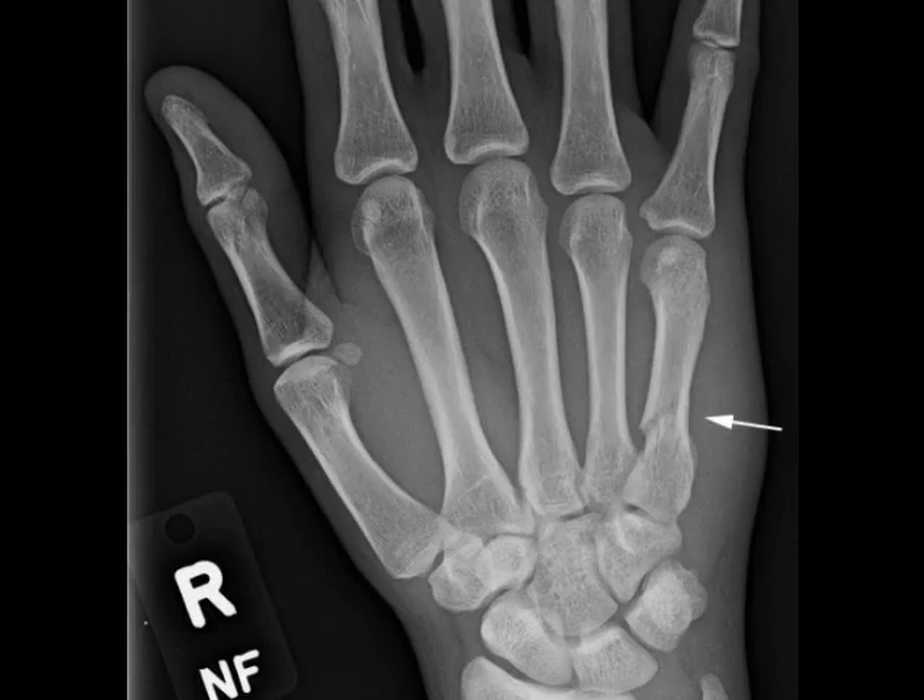The fracture shown here is a stable metacarpal fracture. It has a simple pattern, it's not displaced, and it does not enter a joint — and this makes it an ideal fracture for cast treatment.